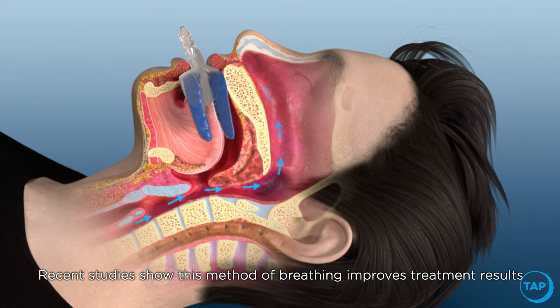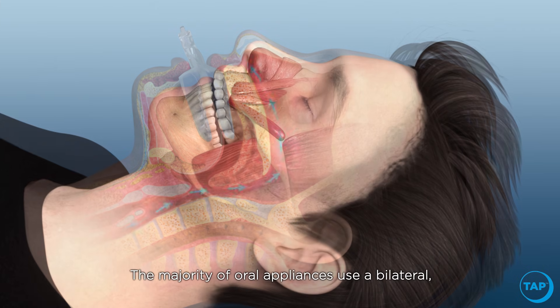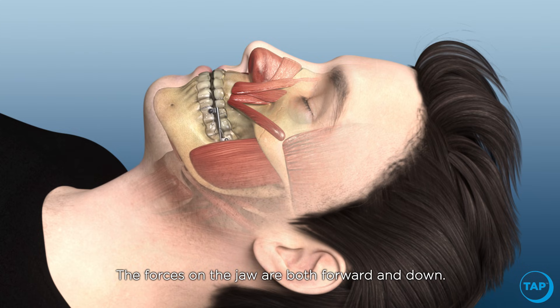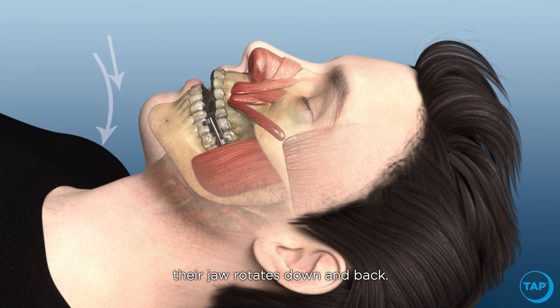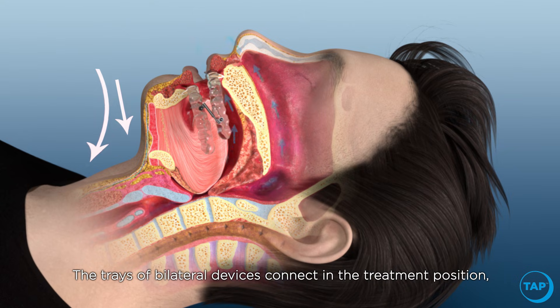Recent studies show this method of breathing improves treatment results. The majority of oral appliances use a bilateral jaw thrust mechanism or hinge. The forces on the jaw are both forward and down with a bilateral mechanism. When a patient opens their mouth, their jaw rotates down and back, pushing the tongue backwards and collapsing the airway.